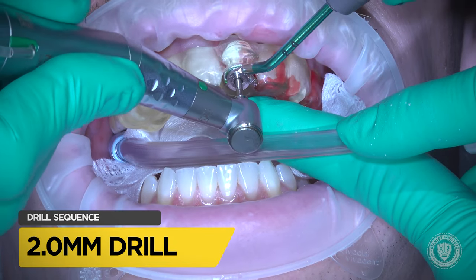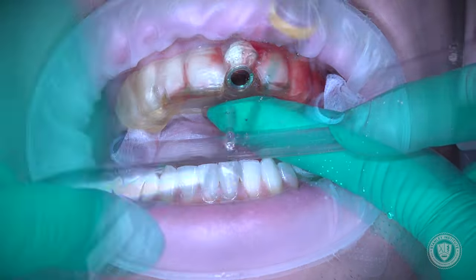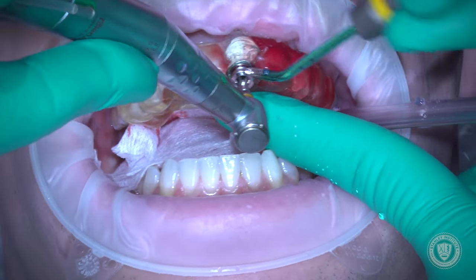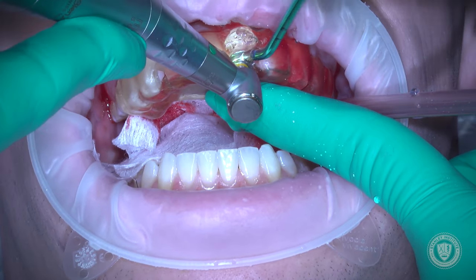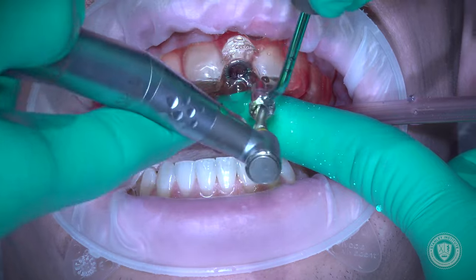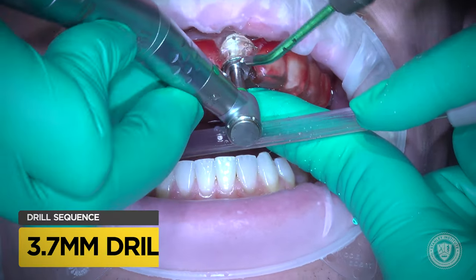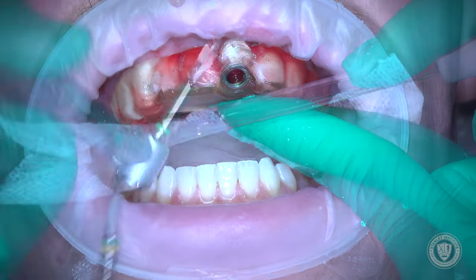We're going to go ahead and decorticate the walls of the socket so that it bleeds really nicely. We put our type 4 surgical guide in place and step through our osteotomies. Each drill is bigger in diameter but the same length — this is a diameter-increasing guided surgery kit from BioHorizons. You can see we've got good bone on the drill as it comes out.